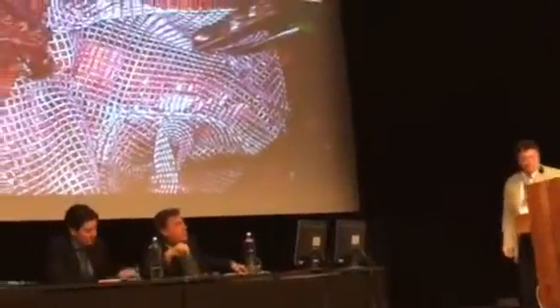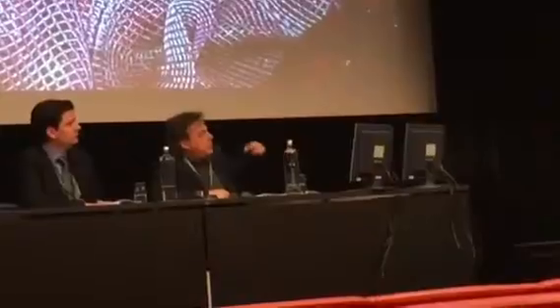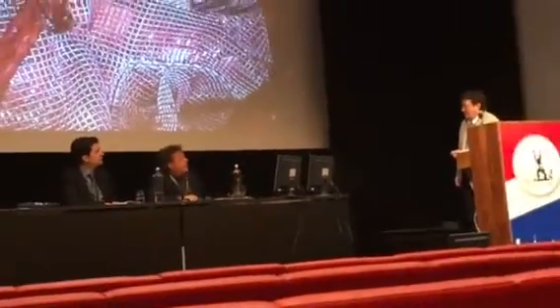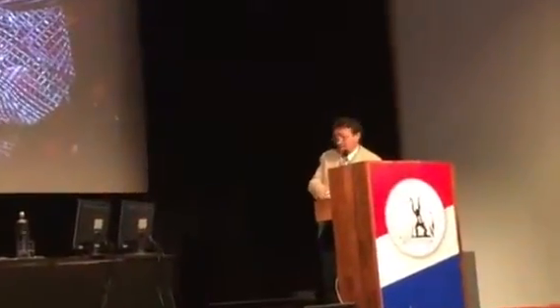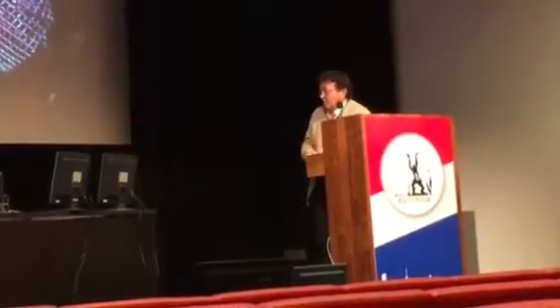Thank you. When you turn to the TEP procedure, do you have to interrupt the peritoneum? Does the piercing of the peritoneum affect your vision when you go back to a TEP procedure? No, because when you enter the abdominal cavity, you enter the peritoneum in a straightforward fashion, whereas when you enter the TEP approach, you enter in an oblique fashion. So the peritoneum closes by itself and doesn't cause any problem.